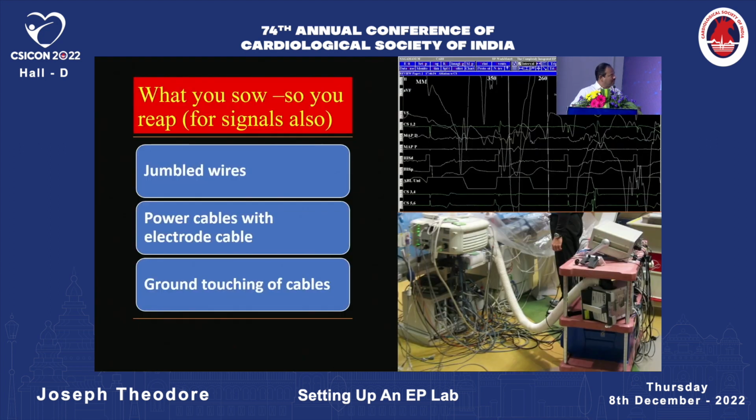Next slide. To get a good signal, you need to be really meticulous here. You need to keep your EP systems connected promptly, and also after finishing the case, you need to preserve them properly. What you sow, so shall you reap. This is true for signals also. So there should not be jumbled wires.